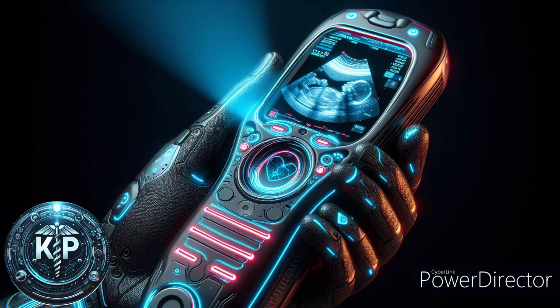In machines equipped with Doppler capabilities, this unit measures and visualizes blood flow within the body. It can display blood flow in different colors on the screen to represent the direction and speed of the flow. Speakers. In Doppler ultrasound, the speakers allow the sonographer and patient to hear the sounds of the blood flow or movements within the body.